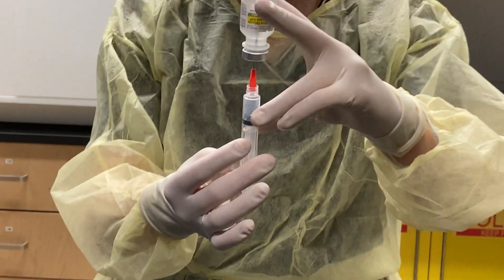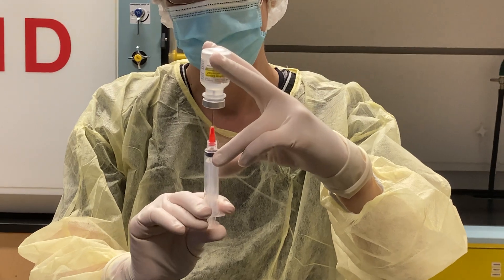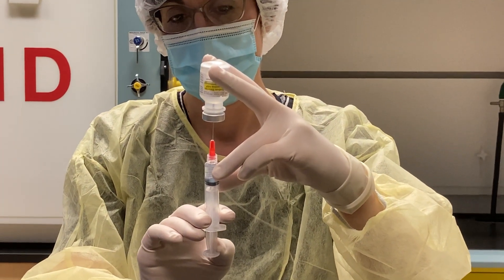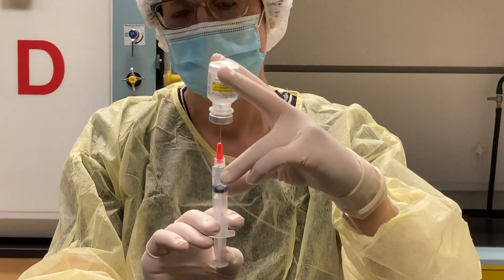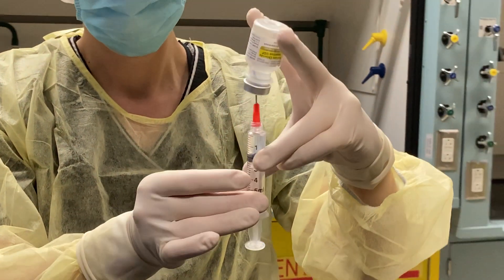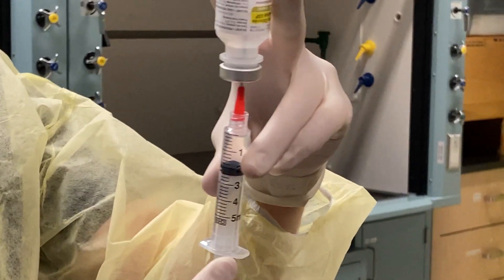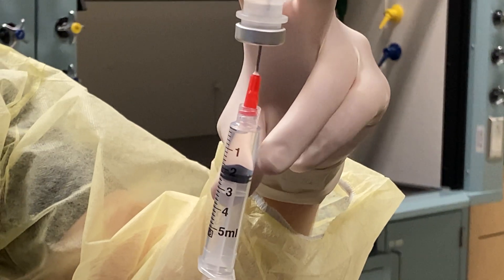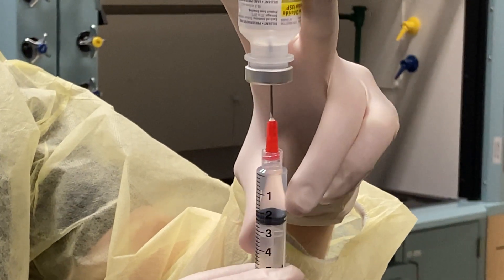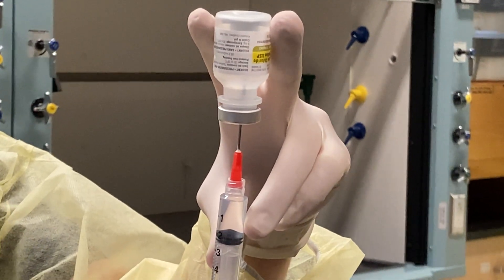Next I'm going to invert my vial and push up the air and draw back the sodium chloride. Then I'm going to tap to remove the air bubbles. I'm going to draw a little bit of air in and push the bubbles out and then push back up to two mils.